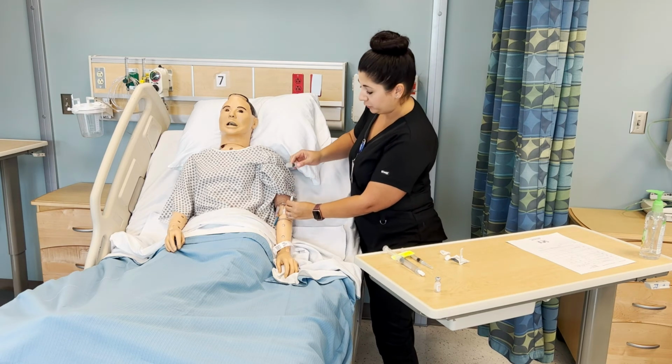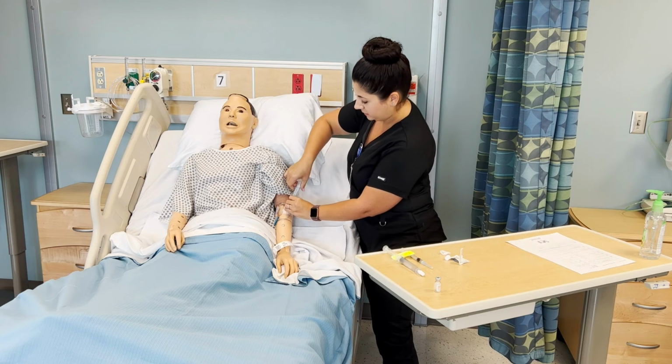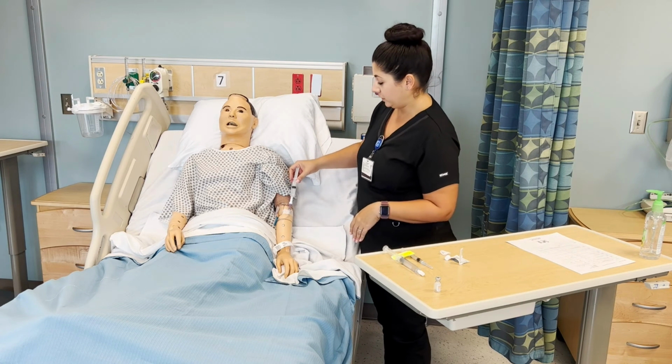Then we will do a pre-flush. This is to ensure that your IV is patent, it's working, it's not infiltrated, there's no phlebitis.